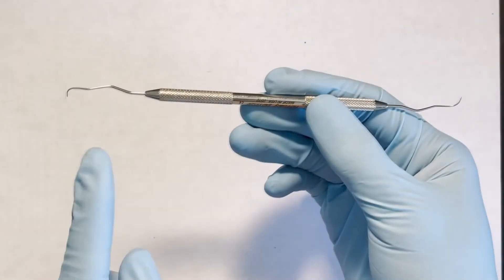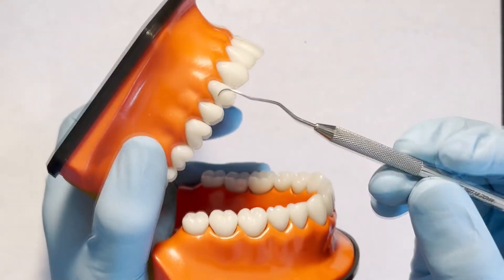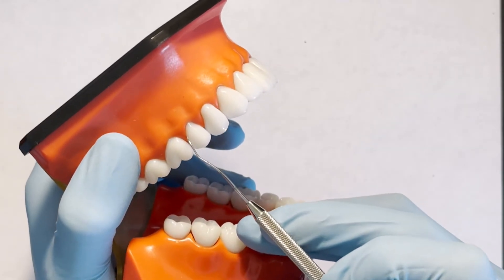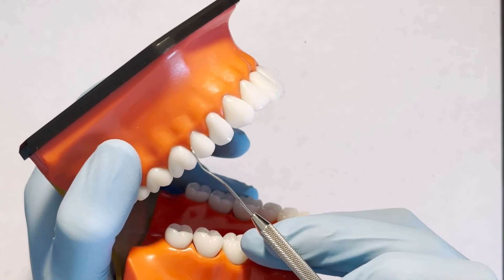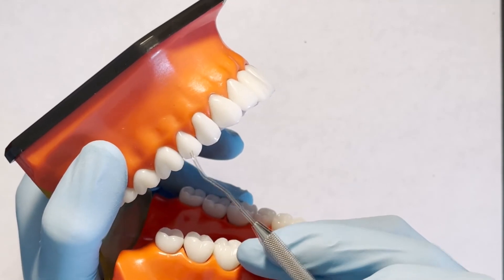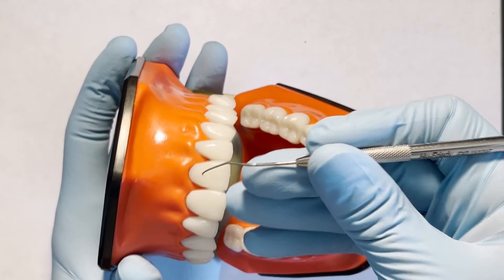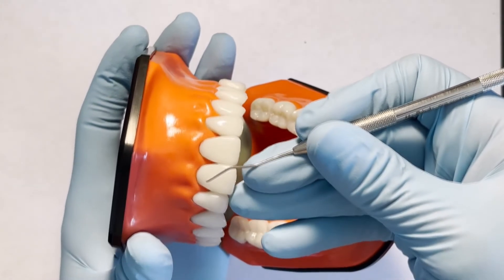The 11-12 Explorer is a double-ended instrument. In order to determine the correct working end for surfaces towards and away, place the tip of the instrument into the interproximal space. For exploring posterior teeth, the terminal shank should be parallel to the mesial and distal surfaces. For anterior teeth, when using the correct working end interproximally, the terminal shank should go across the facial or lingual surfaces.